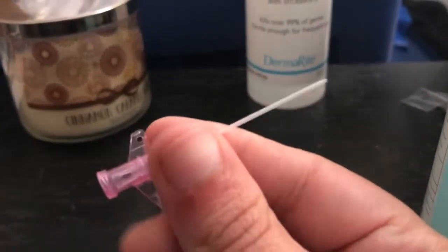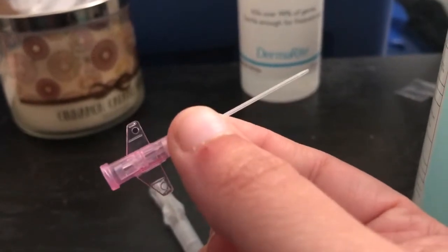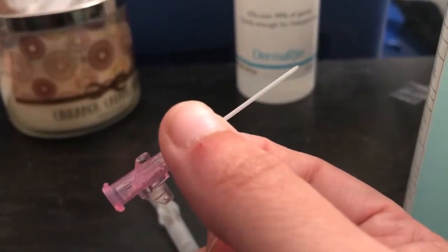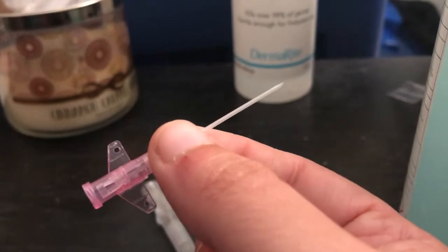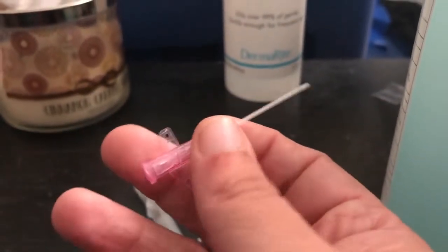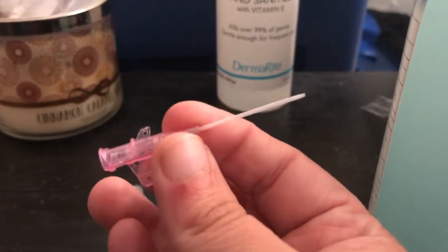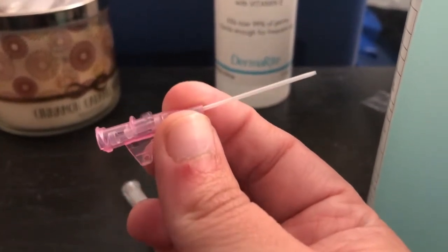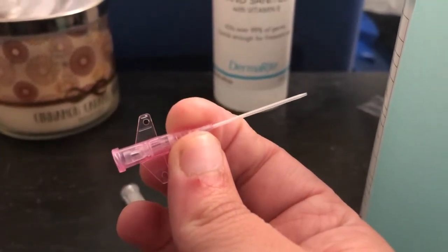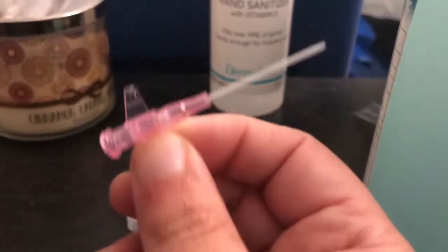And I just wanted to let you guys know, this is what is in your hand or your arm, because I have a lot of people ask me about why needles are left in your arm when you get IVs. There is no needle. This is a very tiny venous catheter. So this will be left in your arm once the IV is there. They do not leave a needle in your arm. It's just a little catheter.